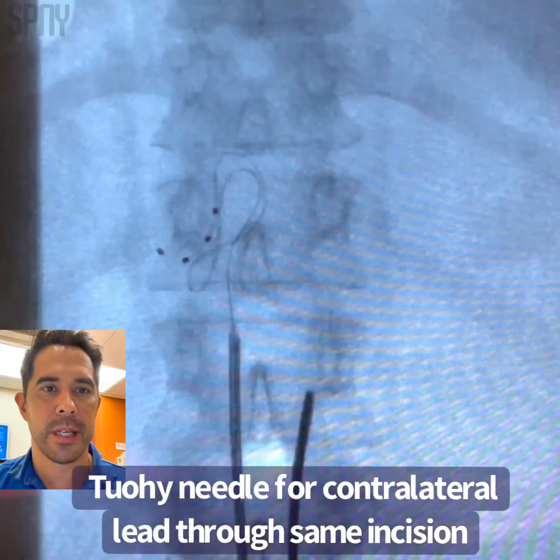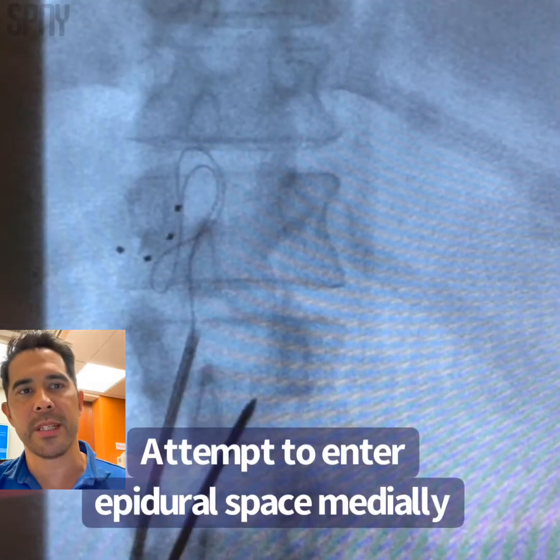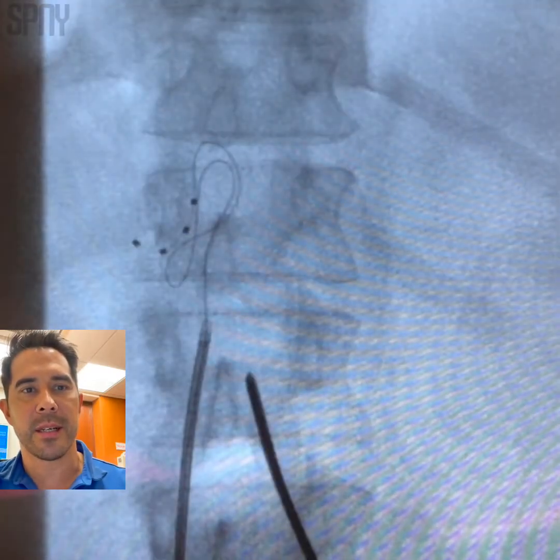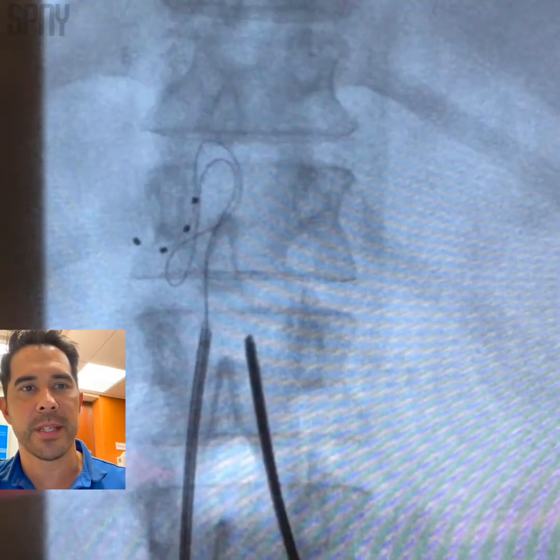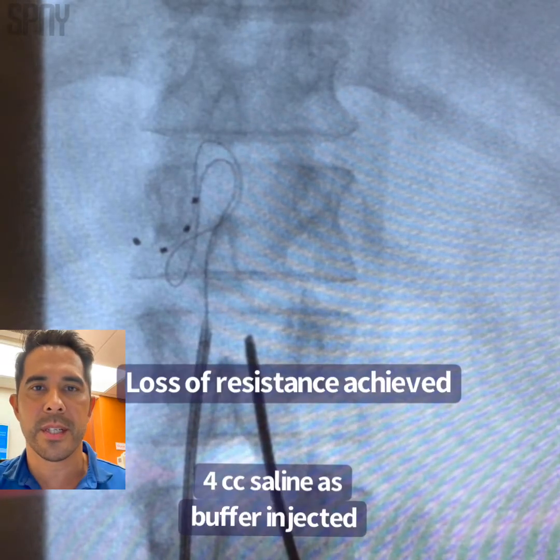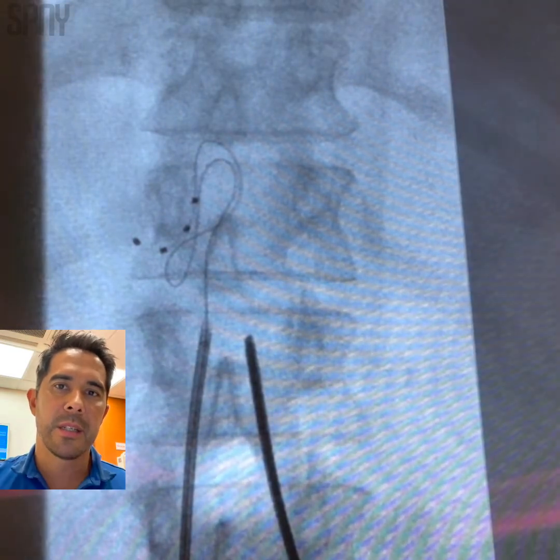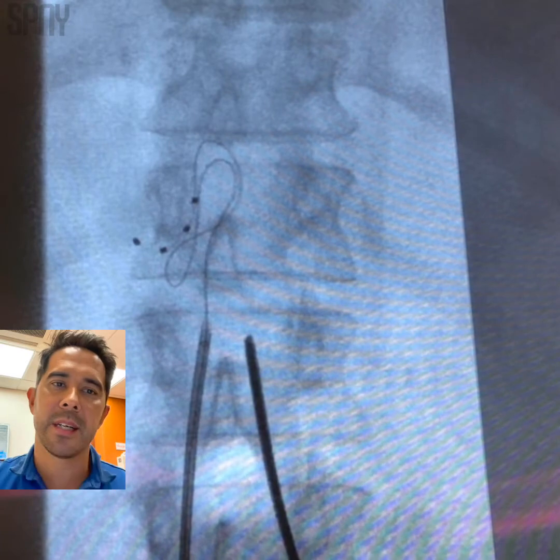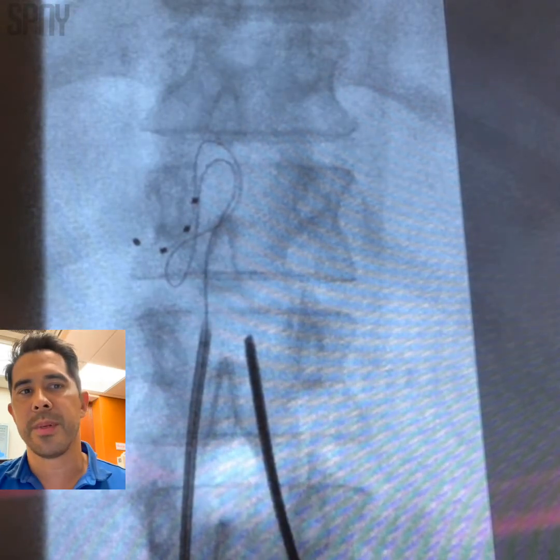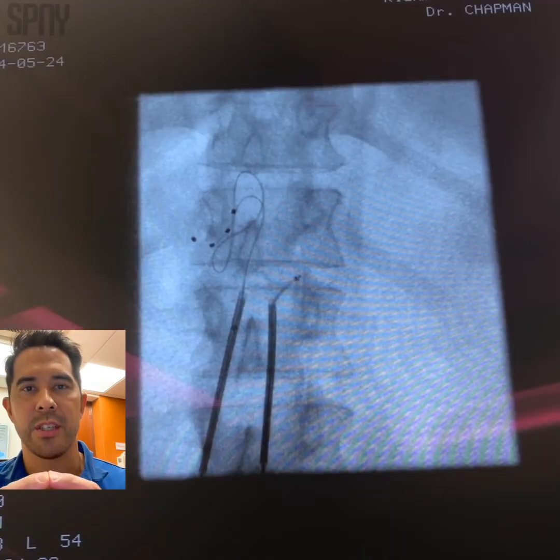Now we're going to put in the other lead. You can see here that we obliqued it to the working side to increase that space. I'm trying to access in the middle of the epidural space. It looks like we got loss of resistance there. We inject four cc's of normal saline to create a buffer just to prevent any kind of scraping or irritation to the cord when we're up in this zone. Again, these are placed through an incision that was put beforehand.